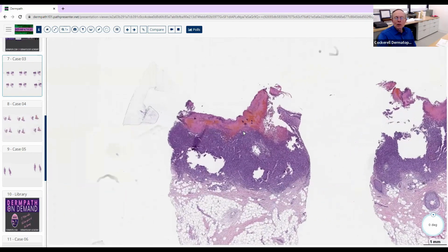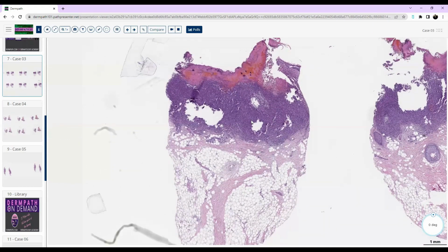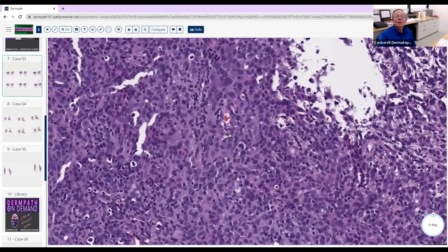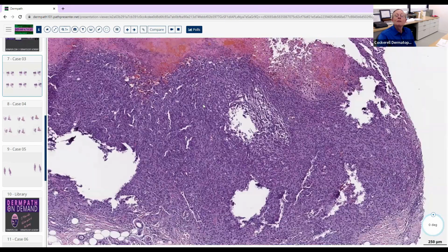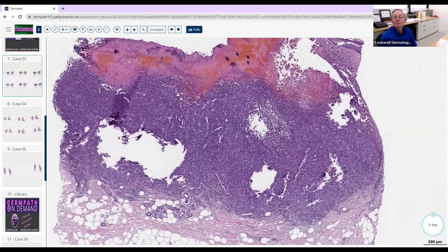So you think these are all inflammatory cells here? Yes. And what kind of cells are these? Lots and lots of histiocytes. Okay, so you thought this was histiocytic. Yes. So when histiocytes predominate, what do we think about there? I'd want to rule out an infection. Okay, so infectious. So you're thinking this is in the granulomatous category?